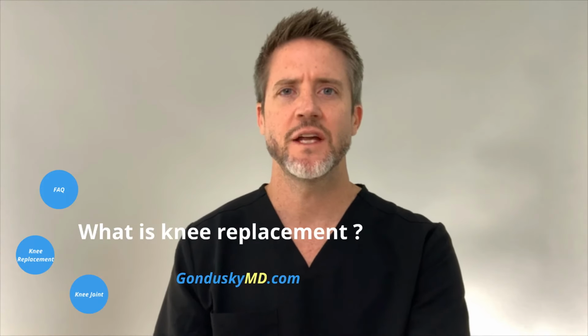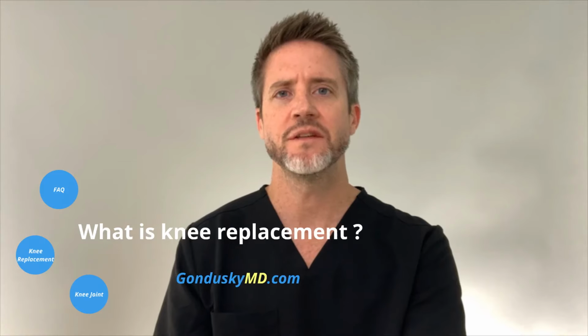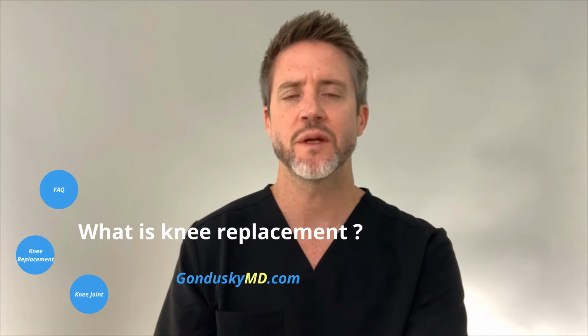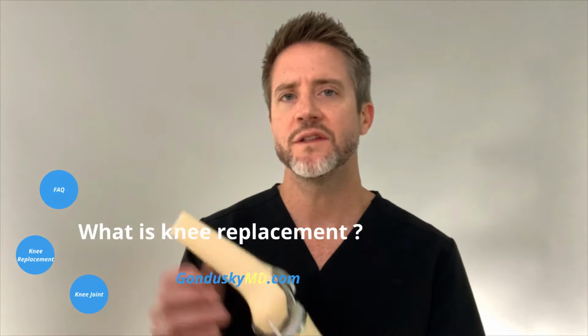I'm going to talk right now about what a knee replacement is. Knee replacement is one of the most common surgeries in America, and you probably know somebody who's had a knee replacement. I'm going to teach you a little bit about what it is. Okay, this is a knee replacement.